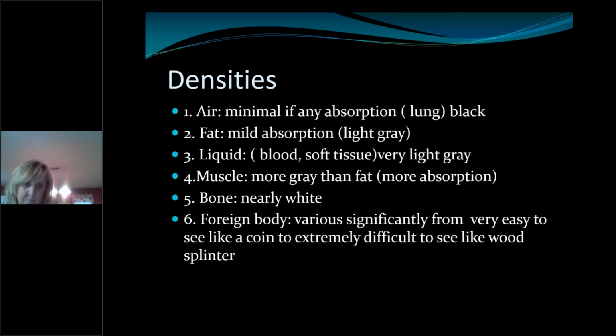Liquids can vary quite a bit as well, depending on how congealed they are. So those are going to be kind of more of a lighter gray. Obviously, muscle is a little bit more dense, so there's more absorption. And in bone, we hope it's almost white. Obviously, if a patient has osteopenia or osteoporosis, that could certainly change.